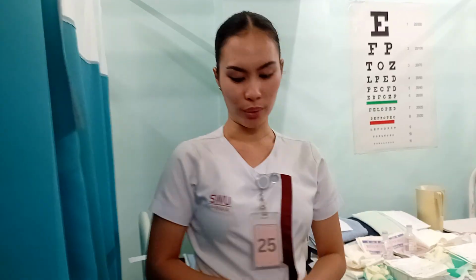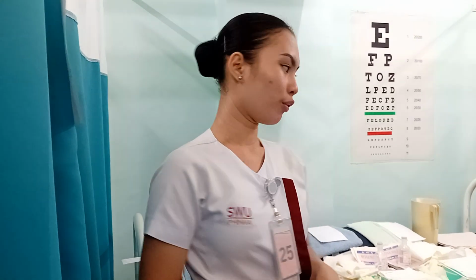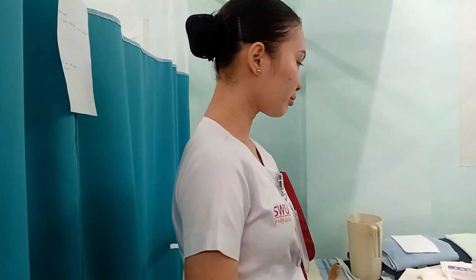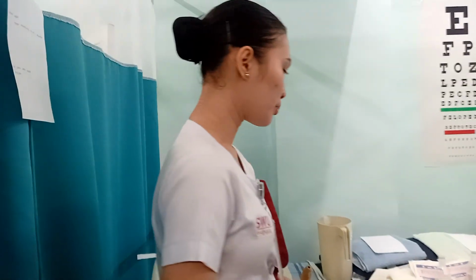Assuming you already wear the gloves, what's the purpose of wearing the gloves? We are going to perform perineal washing. Assuming you're done with cleaning the perineal area, what will you do with your gloves? After, we are going to remove our gloves. And then we're going to open the catheter package.